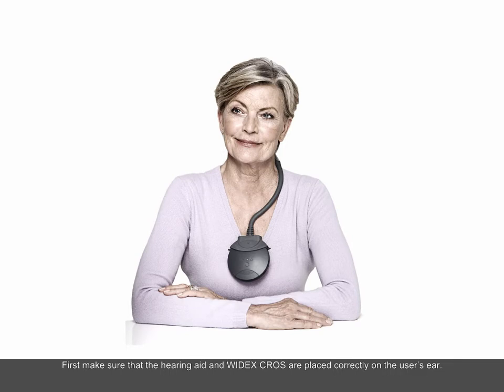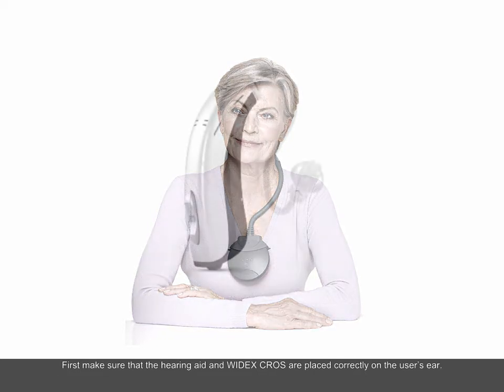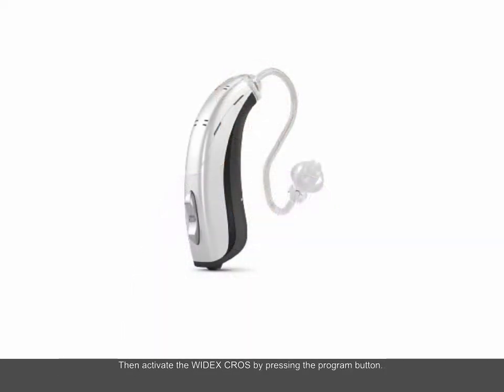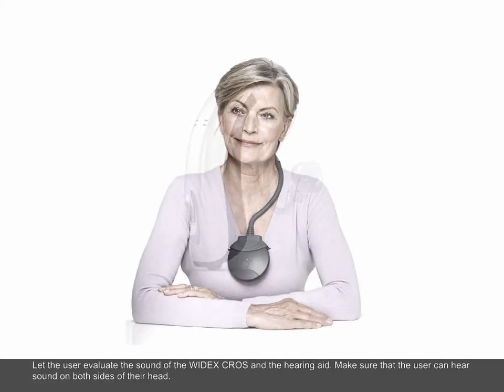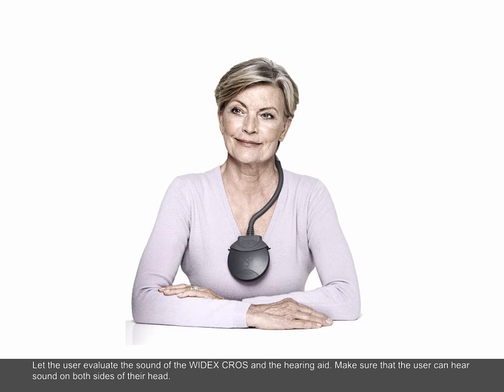First, make sure that the hearing aid and Widex CROS are placed correctly on the user's ear. Then activate the Widex CROS by pressing the Program button. Let the user evaluate the sound of the Widex CROS and the hearing aid. Make sure that the user can hear sound on both sides of their head.